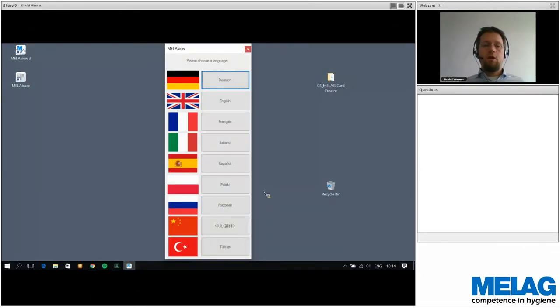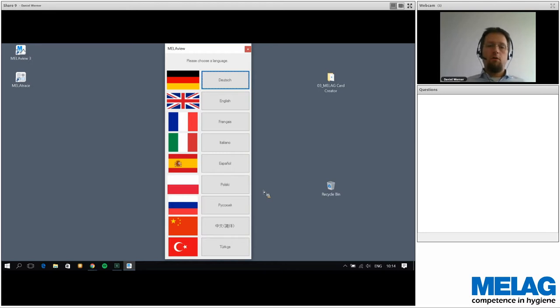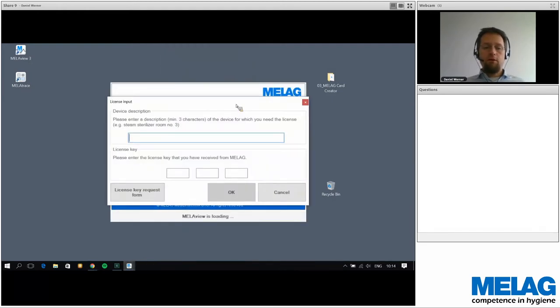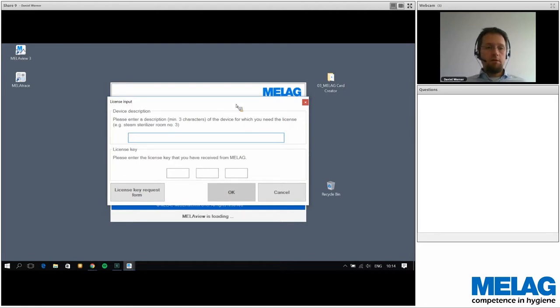The first step is to choose the language. Many different languages are available; for this webinar, English is selected. Then we come to the first point of licensing — if you have the fully completed registration form with all device licenses in front of you, you can begin with the first machine.